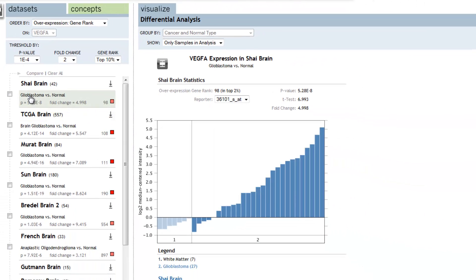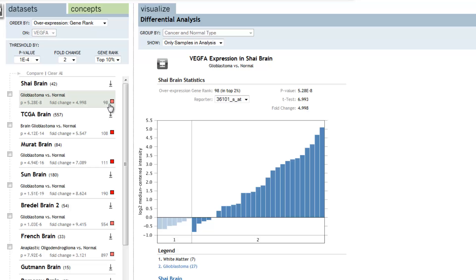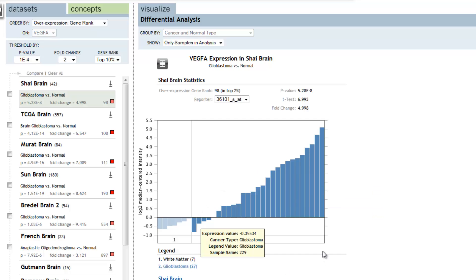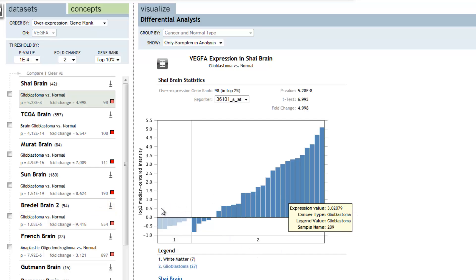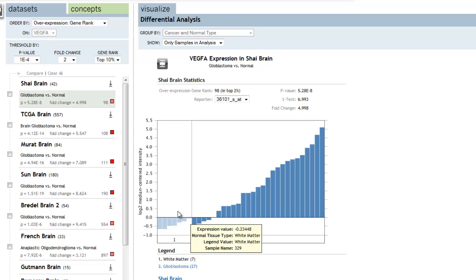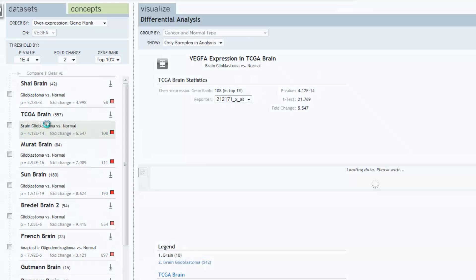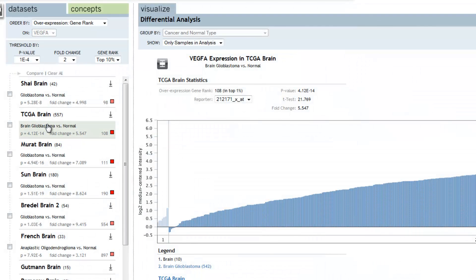Here we see glioblastoma samples compared to normal tissue. In this comparison, we have a significant p-value, a fold change of near 5, as well as a significant gene ranking, this being the 98th best gene in the analysis within this study, the Shy brain study. The plot to the right shows us the individual patients as bars indicating the distribution of overexpression of VEGF in the glioblastoma patients relative to white matter, normal tissue. We can continue down through the other datasets that support this finding.